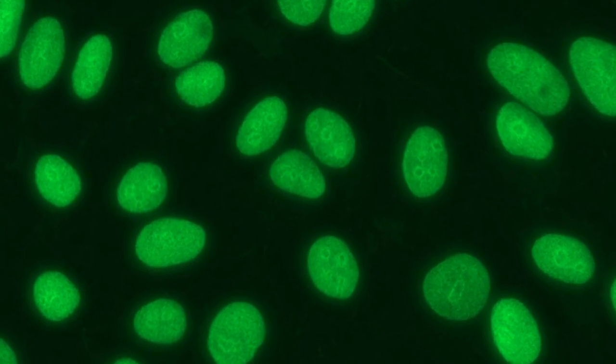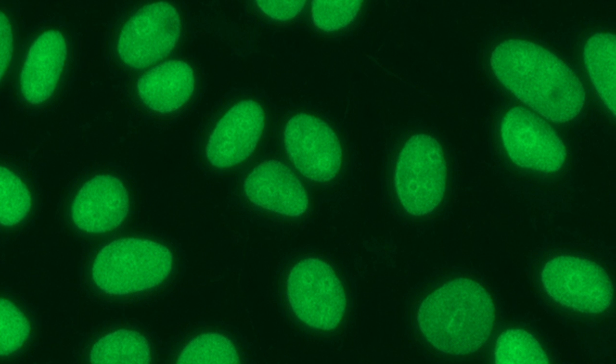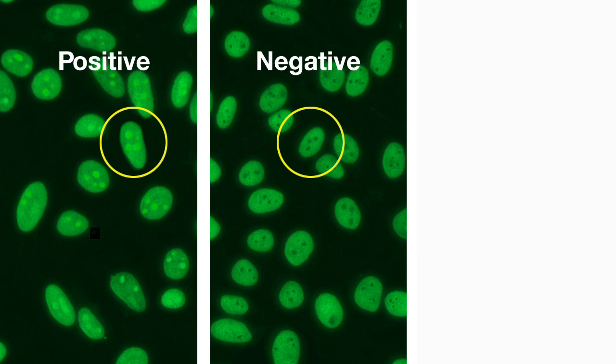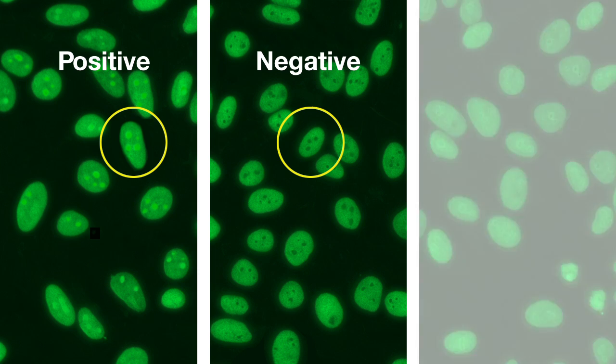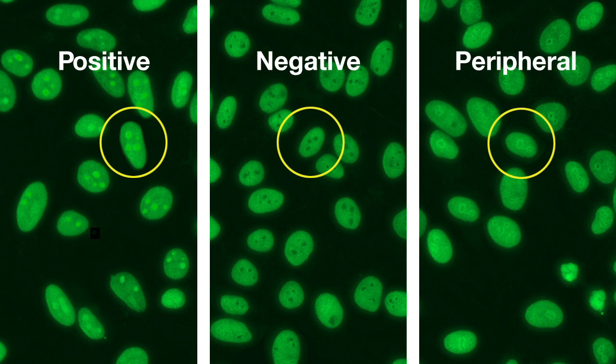Next, look at the nucleoli. The size and number of nucleoli vary depending on where the cell is in the cell cycle. Staining can also be variable — it could be positive, negative, and in some samples, show a peripheral staining.